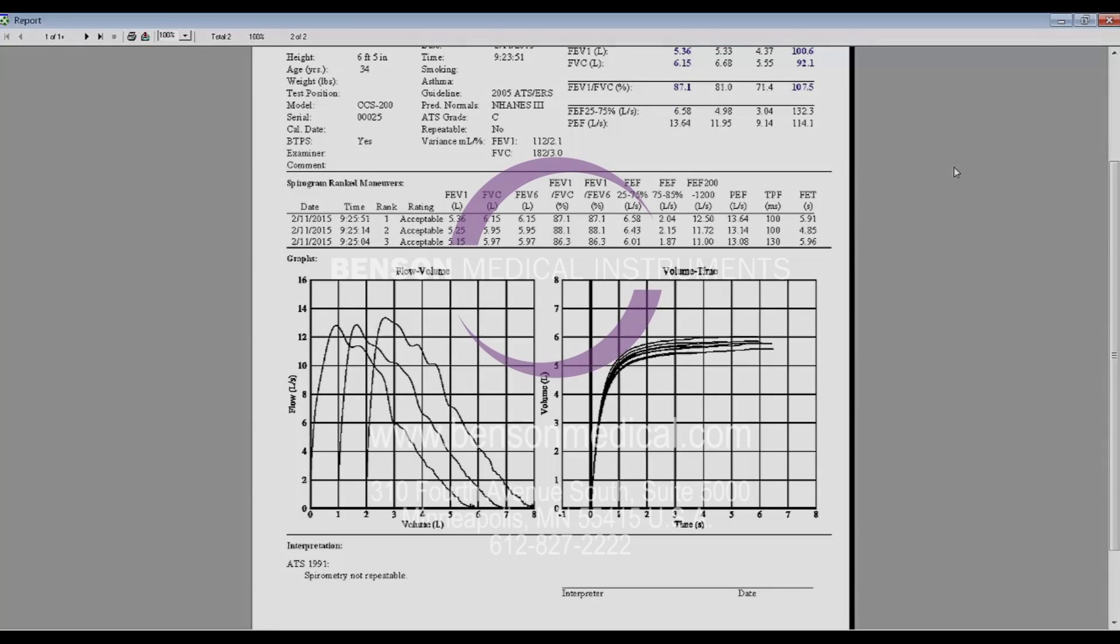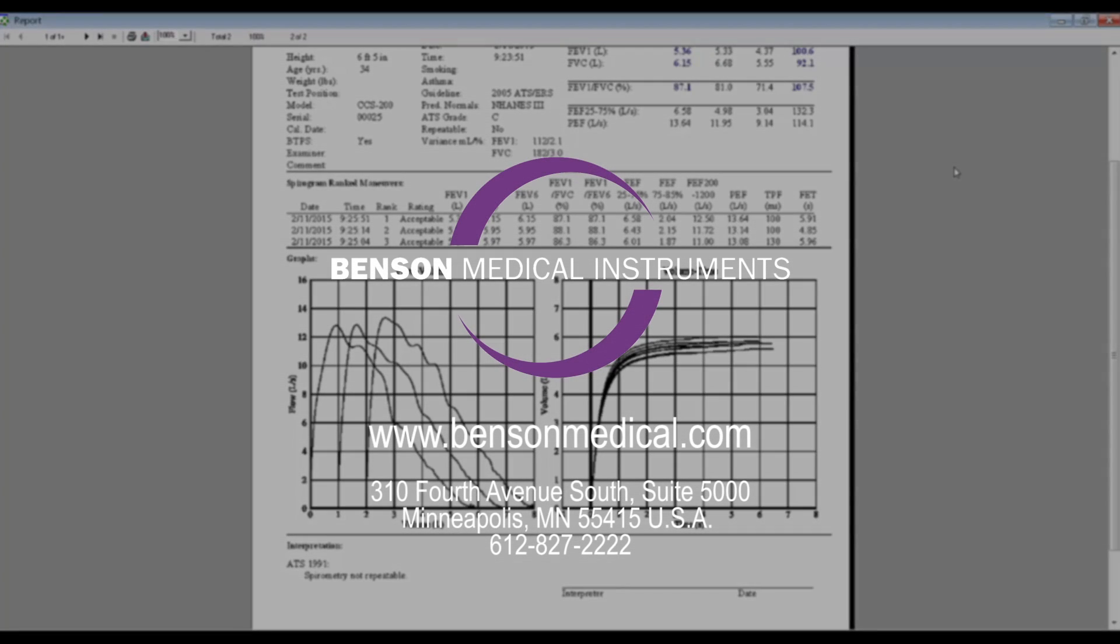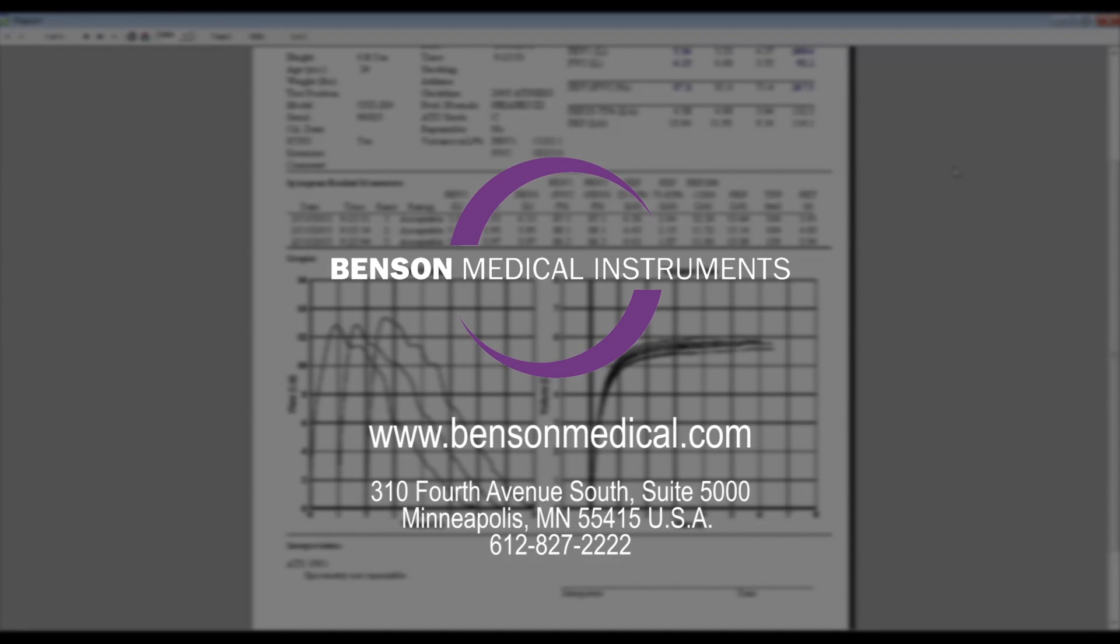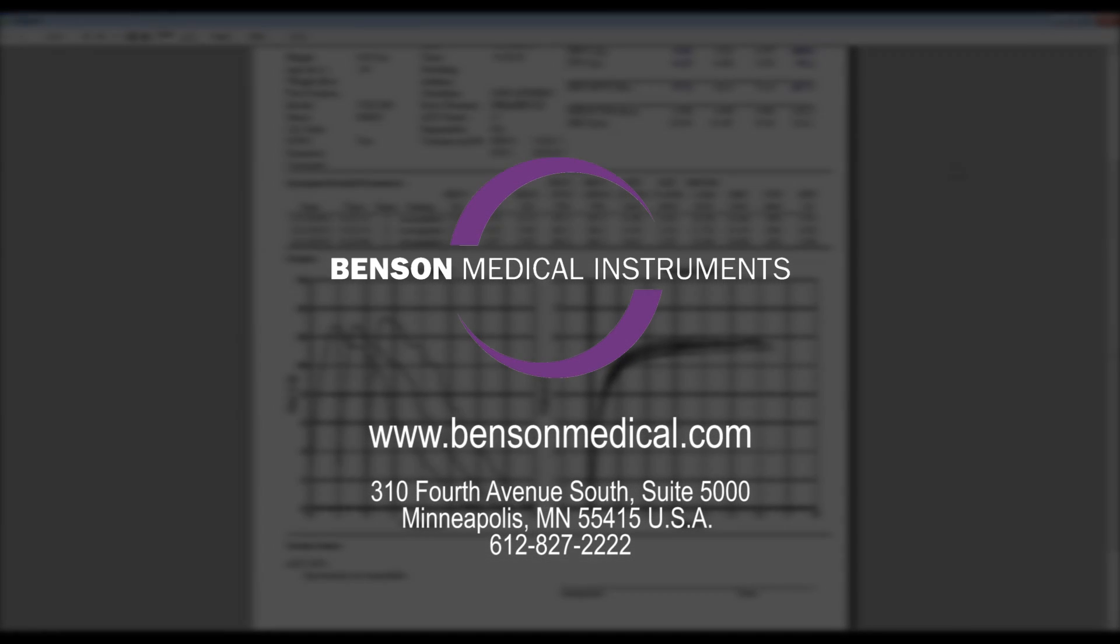In this video, we demonstrated the flexible options for designing spirogram graphs. Be sure to watch other videos in this series on powerful solutions for occupational health compliance.